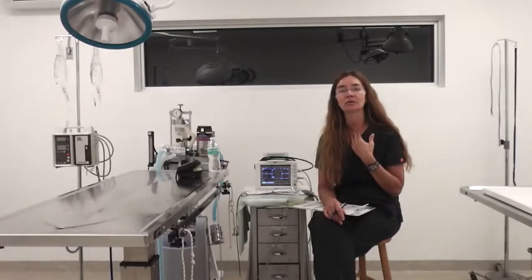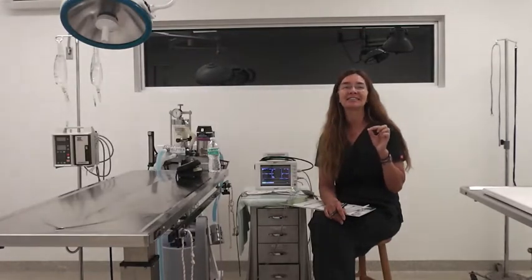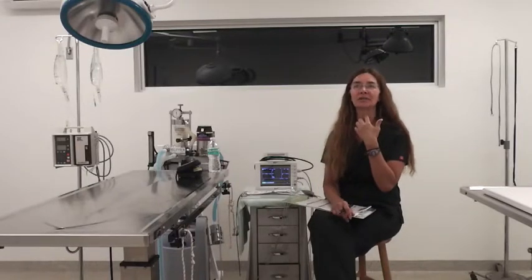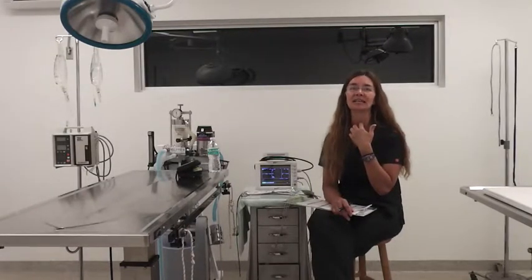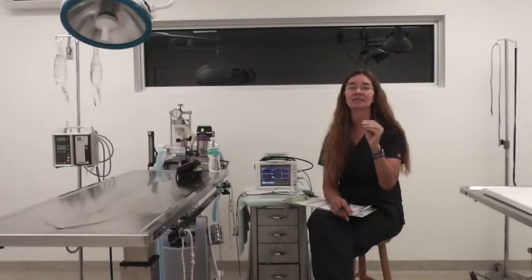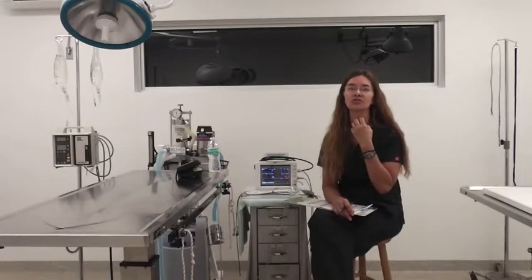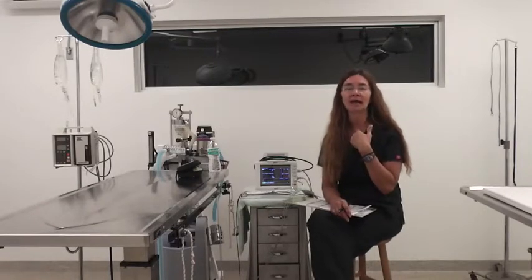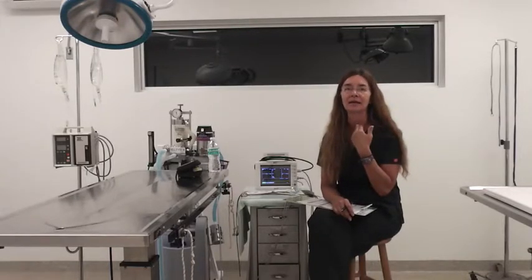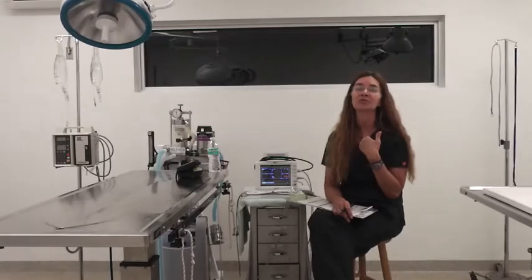Another reflex we see or use during anesthetic procedures is the laryngeal reflex. This happens when anything that you try to put down the throat touches the epiglottis, such as trying to tube them. It closes, and this protects the patients from any tracheal aspiration. So you'll see that it's really fun trying to tube a cat. Once you touch that, everything shuts up, and we call it trying to play the shooting game, getting that tube down in a cat's throat. So you see this in really light stages of anesthesia.